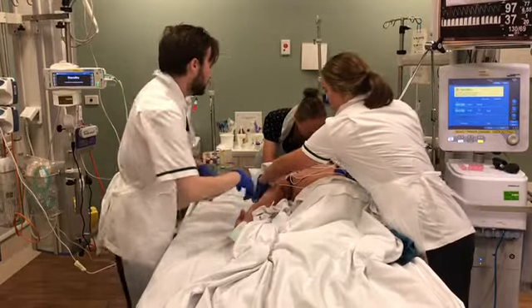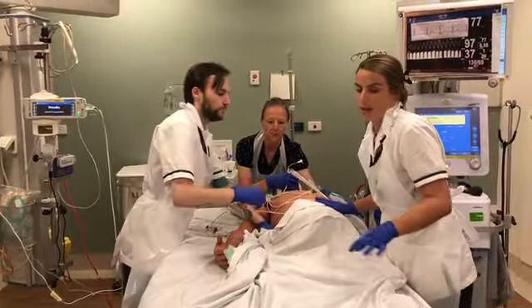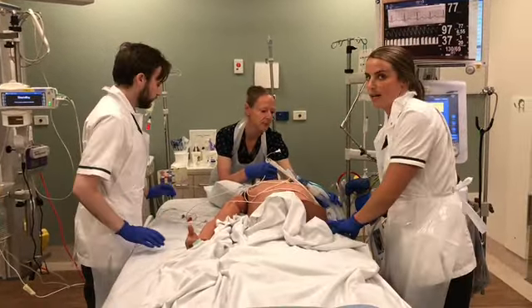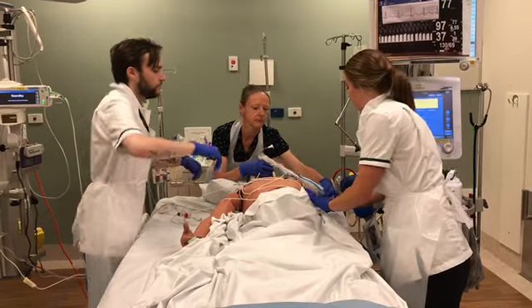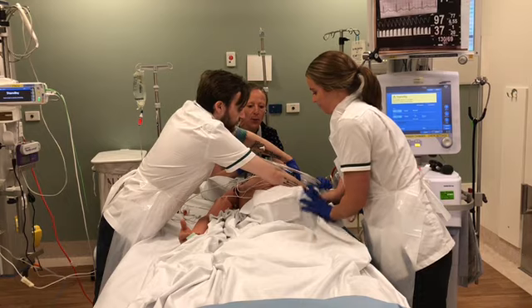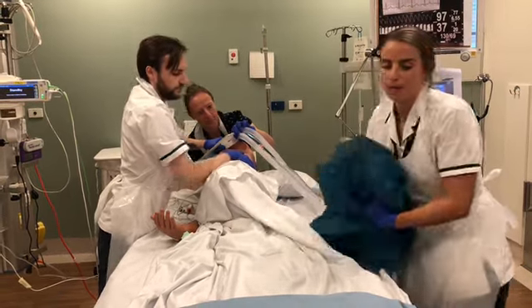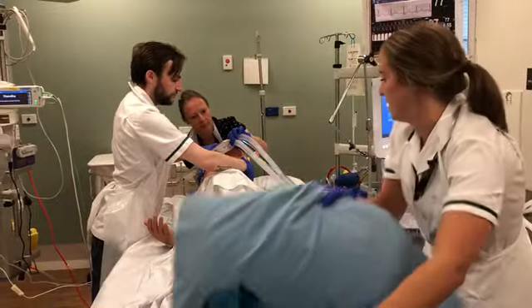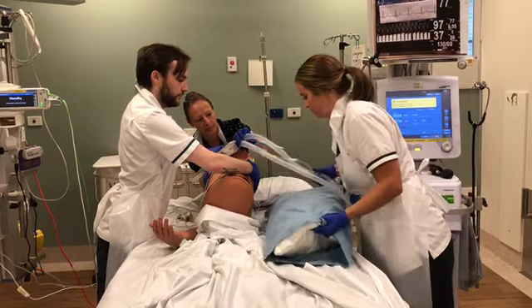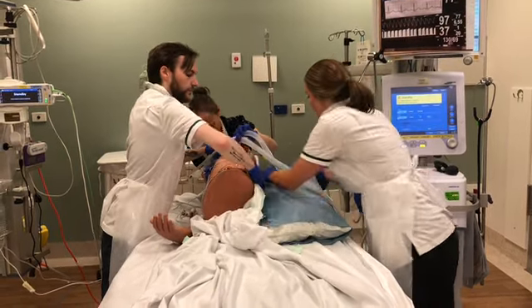Just making you nice and comfortable now, sir. Alright, we've got our pillows here prepped that Michael did in the last section. Do one last turn and pop those in. Okay, guys. So on 3, we'll go up to 90. 1, 2, 3. Bringing those slides out, leaving the X-ray one in. Just get that greenie there, Michael. And we'll pop this pillow in.